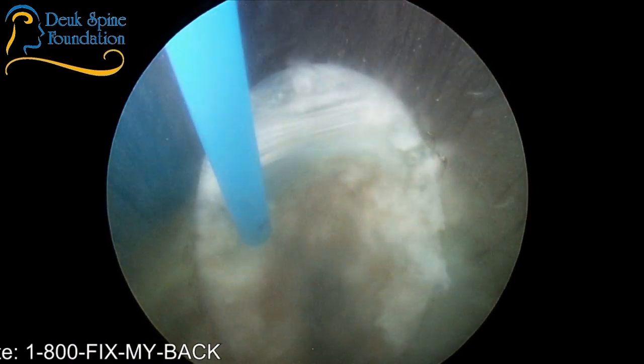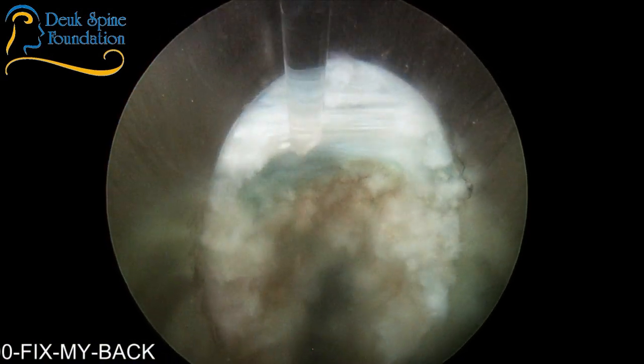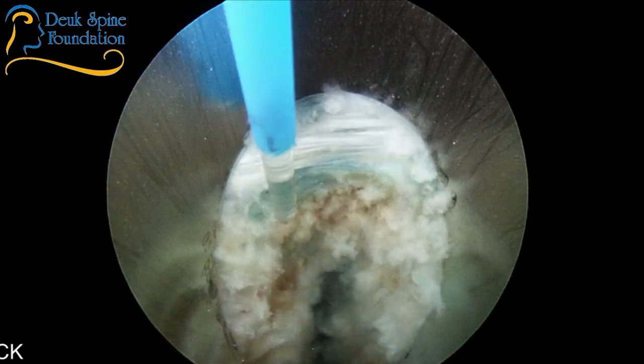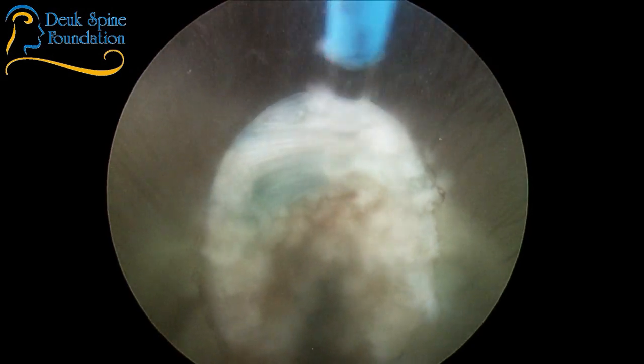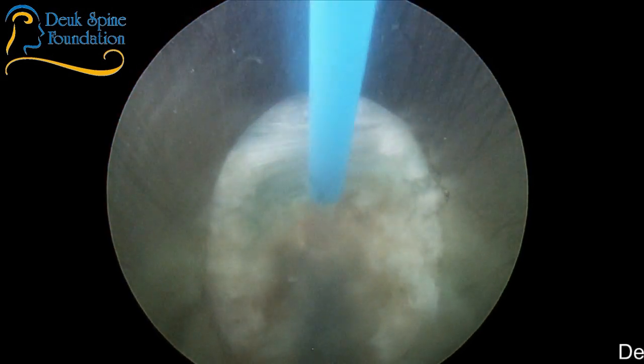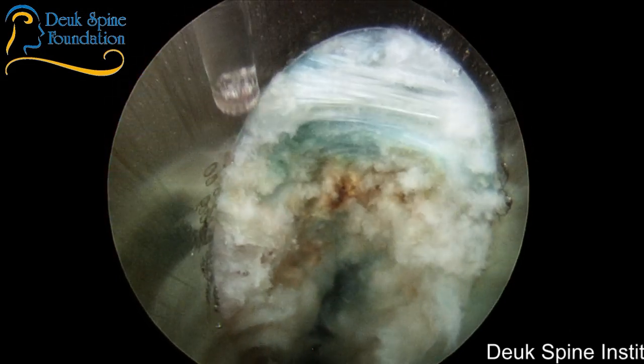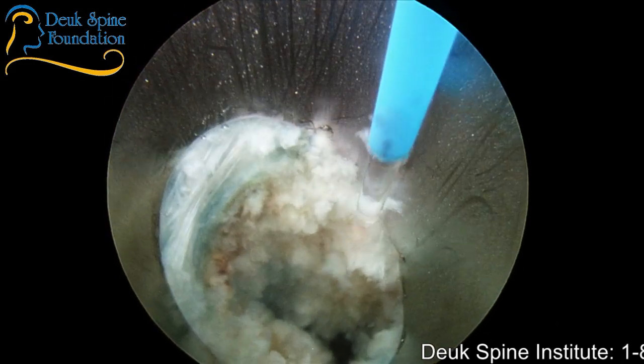All right. Is there another question, Zach? We're just about done here. You can see I've got a little bit of foraminal ligament right here. There's a little bit more of the herniation, but not much. And you're looking at the end plate of one vertebral body and the end plate of the other.